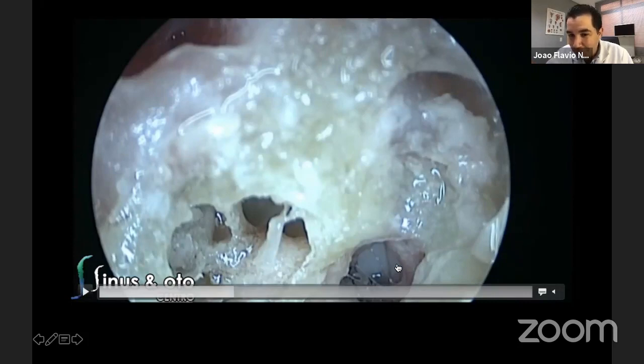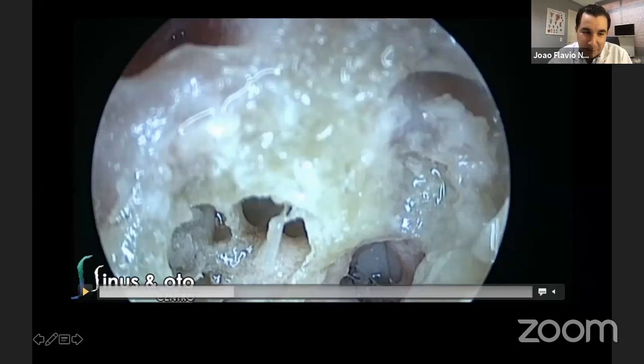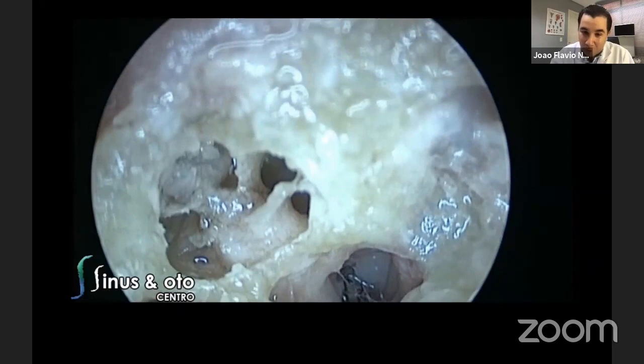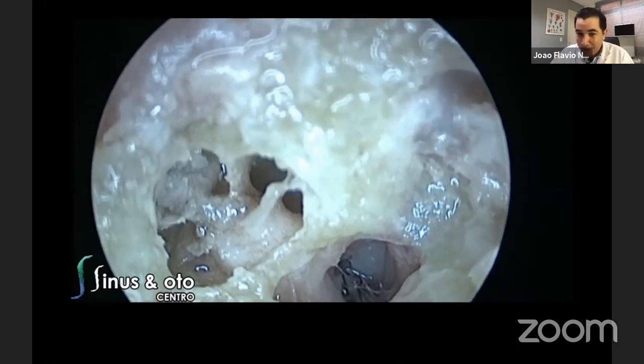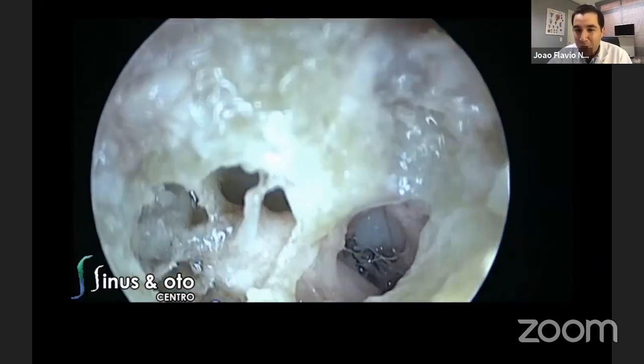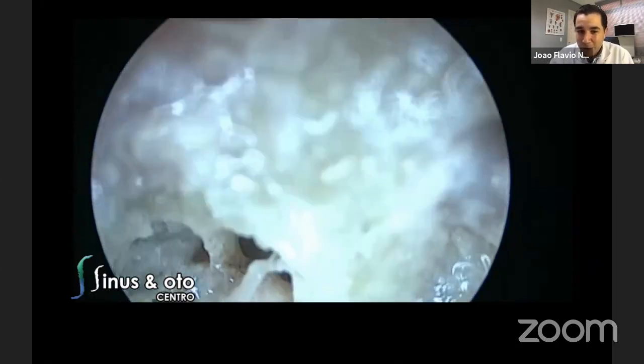So this is the facial nerve. We can see here the posterior superior part of the internal auditory canal. So this is the superior vestibular nerve, and the posterior inferior nerve, which is the inferior vestibular nerve. So we can see all four cranial nerves here inside this internal auditory canal. Of course, sometimes you cannot do these things surgically. That's why I always call this an anatomical demonstration, not a surgical demonstration. So you can see all four cranial nerves in a very good demonstration to understand.